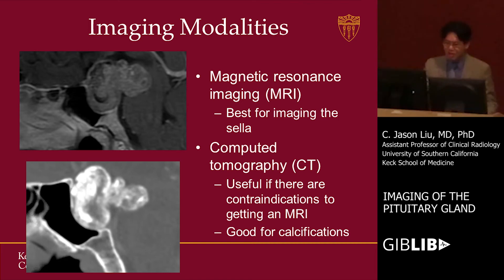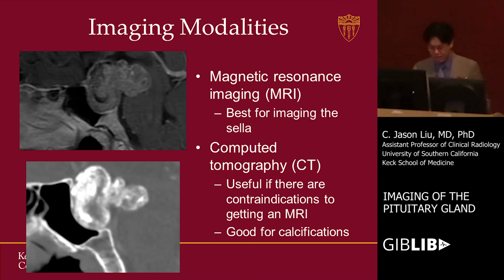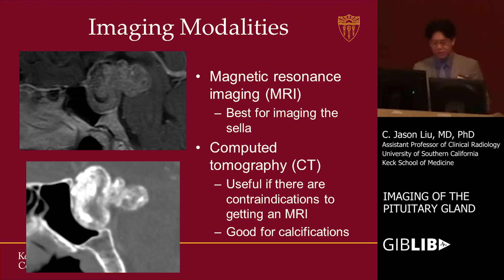One area where CT potentially excels compared to MRI is in the quantification of calcification. This is the CT of the very same patient. We can see portions of the tumor that are very dark on the post-contrast MRI image — as radiologists, we know that could potentially be from calcification. Indeed, on CT we see bright spots in those same areas corresponding to calcium. MRI tends to underappreciate just how heavily calcified the mass is, and knowing that a mass has a lot of calcium is clinically important.